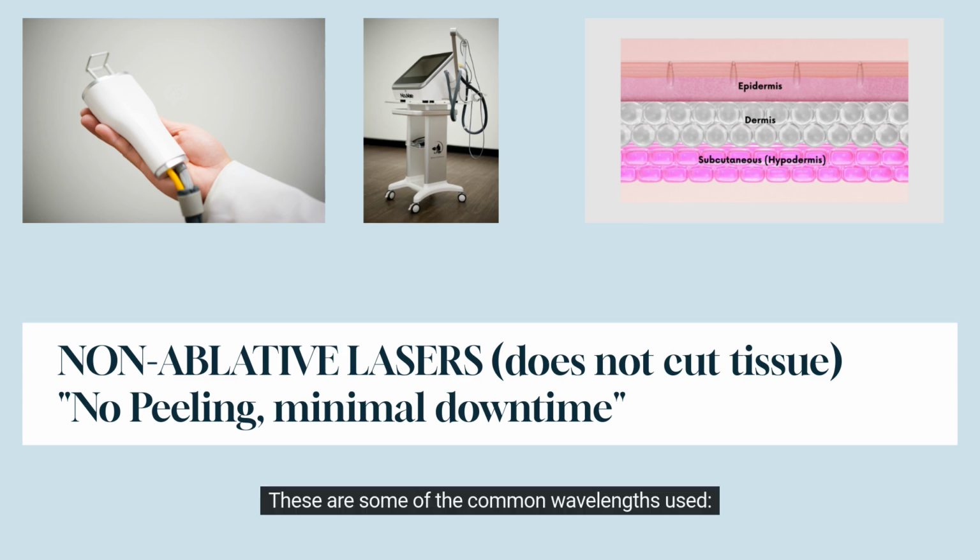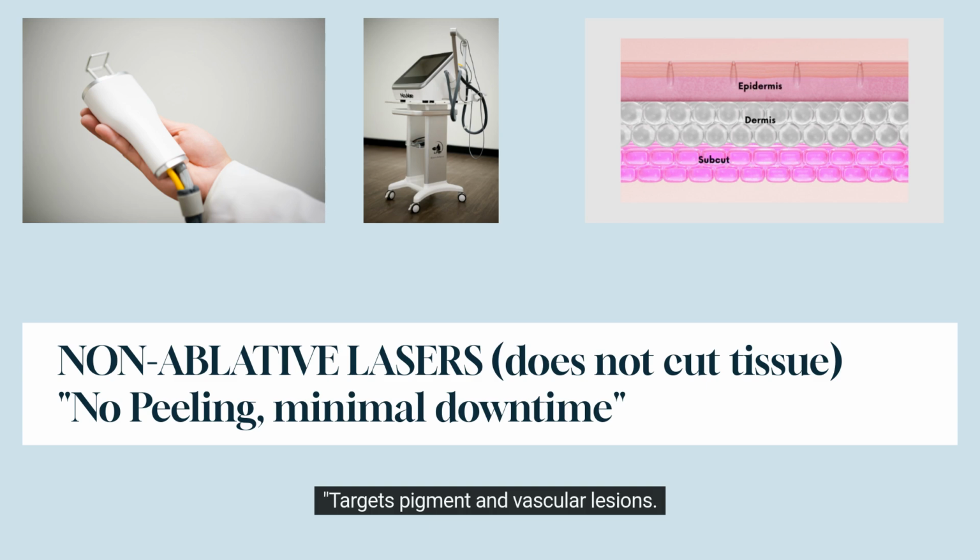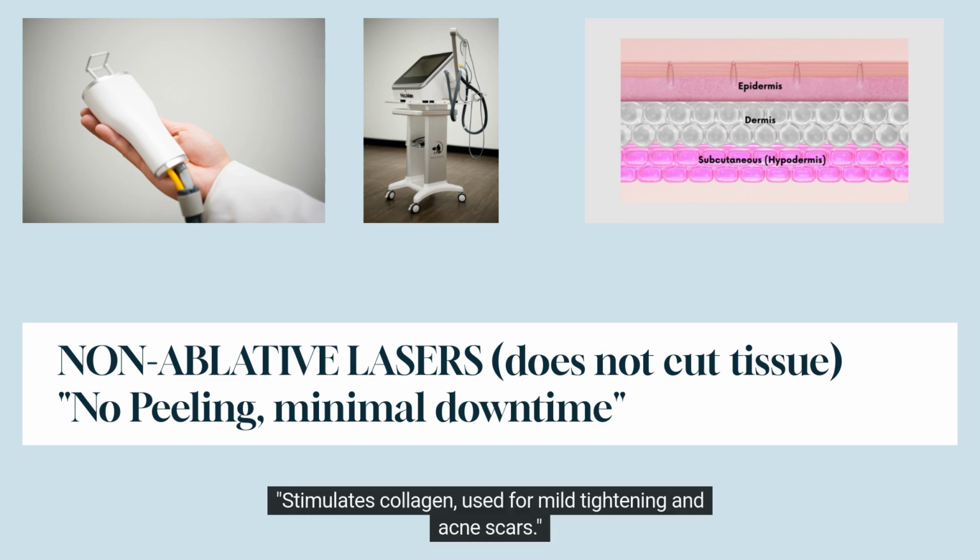These are some of the common wavelengths used. 1064 nanometer Nd:YAG targets pigment and vascular lesions. Safe for darker skin tones. No ablation, deep penetration. 1320 nanometer Nd:YAG stimulates collagen, used for mild tightening and acne scars.